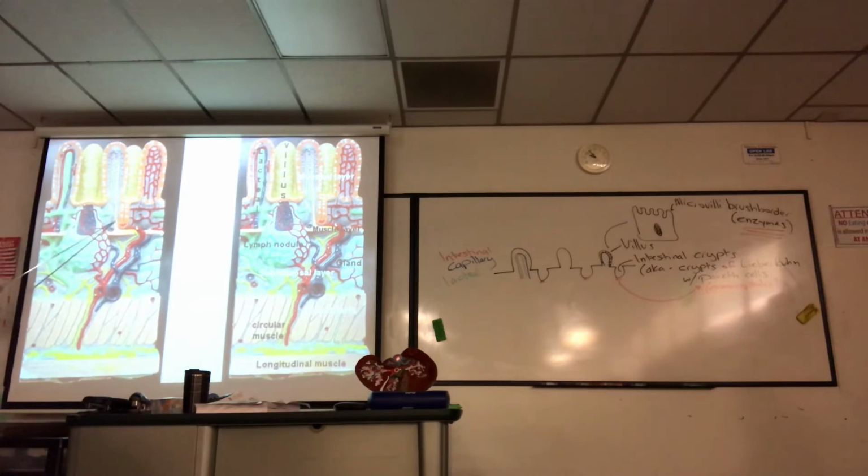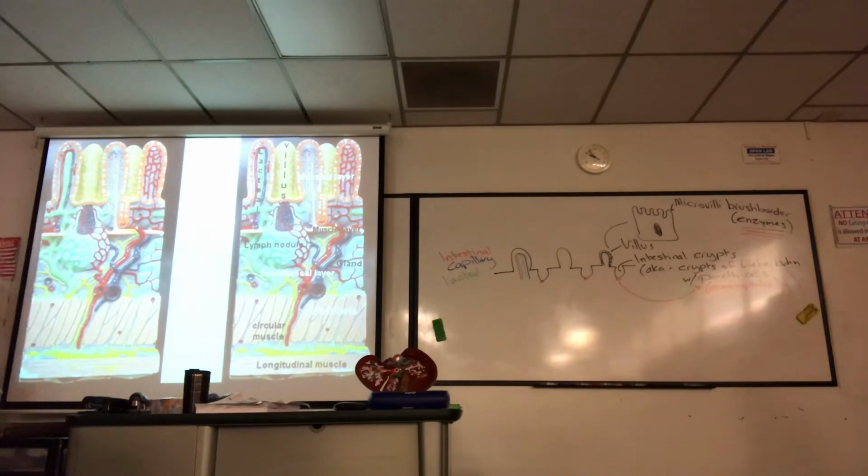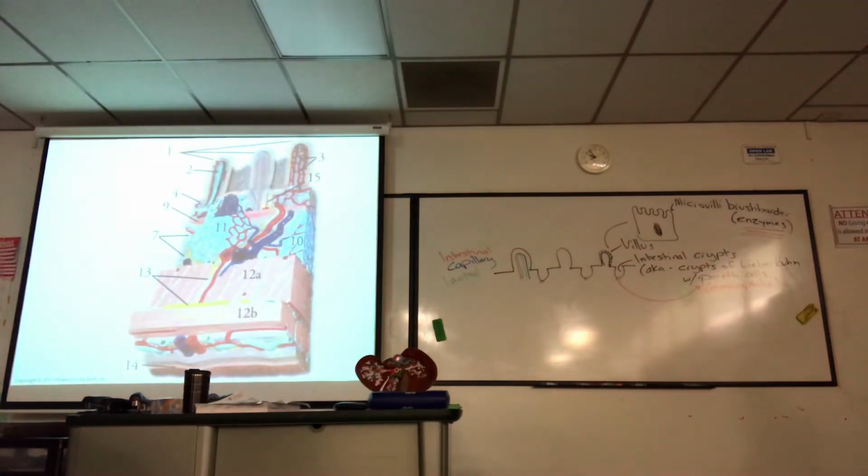Okay. Identify intestinal crypt. Crypts of Lieberkuhn with Paneth cells. See the little red cells at the base? Identify cell, Paneth cells. Right above this layer here, this is the muscularis mucosa. This is MALT. They call it lymph nodule. I didn't make these labels. I don't like muscle layer. It's muscularis mucosa. Okay. Well, anyways, this was on, I might ask you that, what is this? They say gland, but that's not specific enough. Brunner's. Call it Brunner's. Well, anyways, this labels on, labels off is kind of the same as this picture I showed you before. So you can go back and review that if you want.